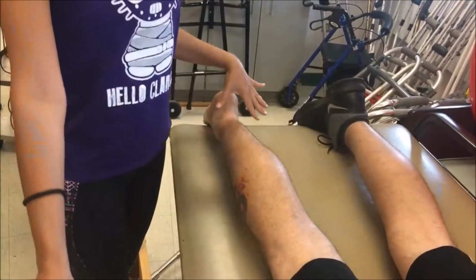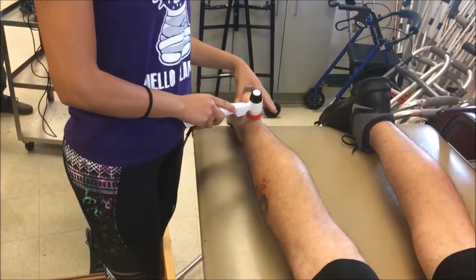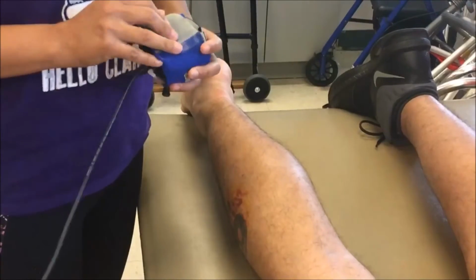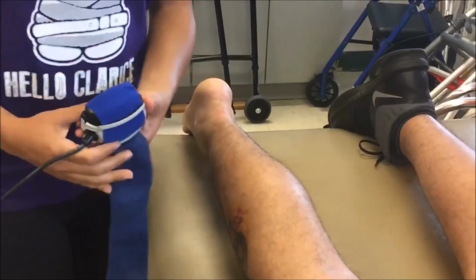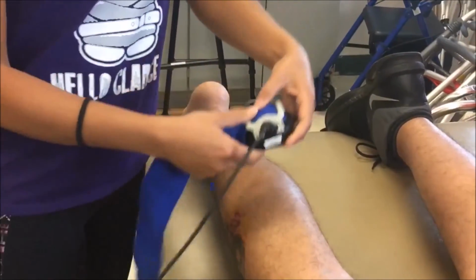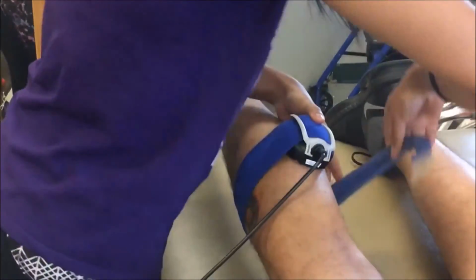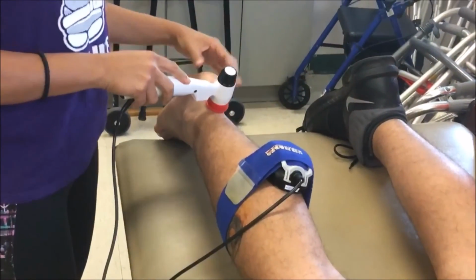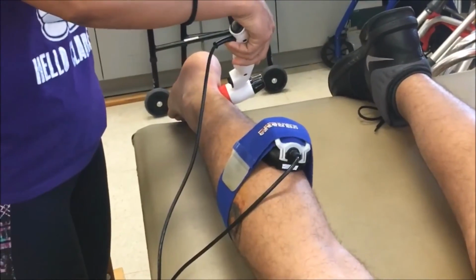If the patient has Achilles tendonitis, we will place the laser on the Achilles tendon, which is in a deeper area, and then we will place the SLD on the gastro, which is more superficial, but it will target the pain on the gastro. We'll just wrap it like this. And then do the laser on the Achilles tendon, and then we'll move it around on each side of the tendon.